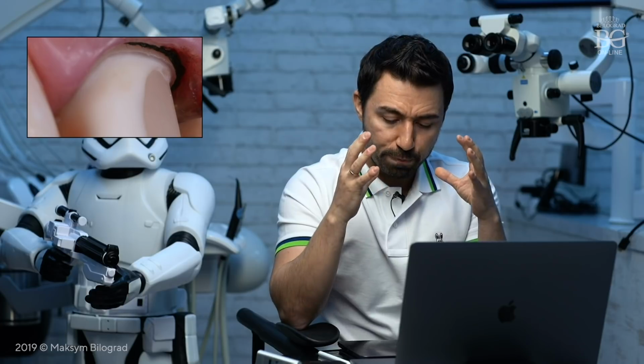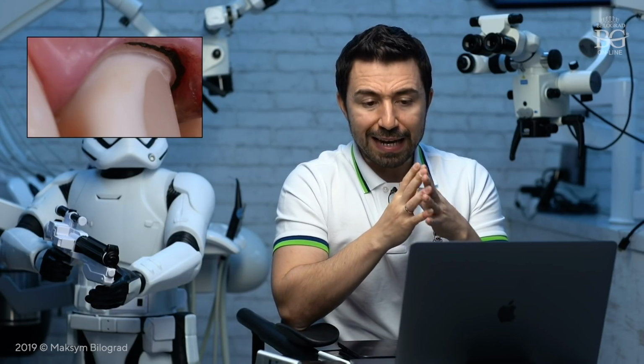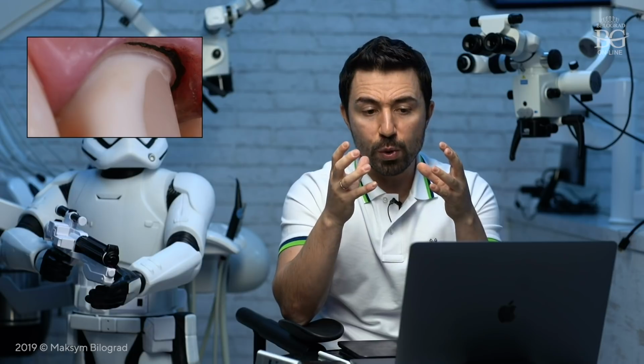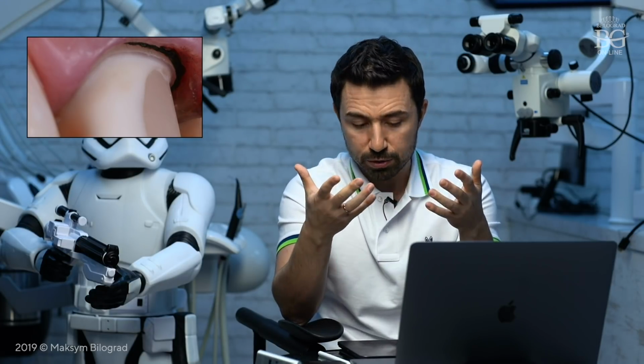Then we put temporary crowns for this patient and kept our patient 4 weeks, because we need to keep 4 weeks in that kind of cases, because within 4 weeks the new epithelium connection, the new epithelium junction, develops.